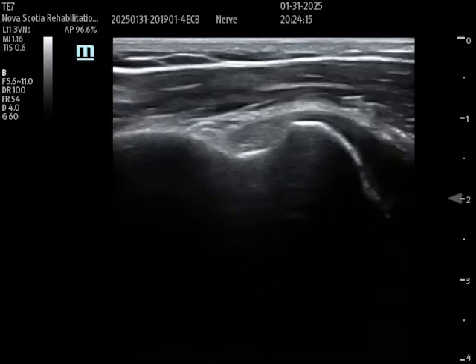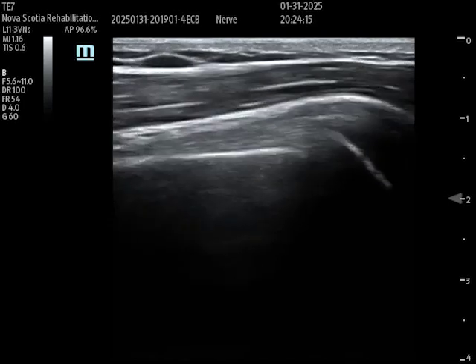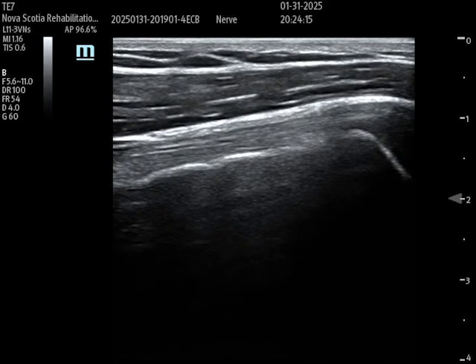You can also do these injections in long axis. Here I've got the biceps tendon in short axis, and then I rotate the probe 90 degrees to bring things into long axis. There's the biceps tendon labeled. You could do an injection in-plane, guiding the needle just above the biceps tendon in the sheath using this long-axis approach.